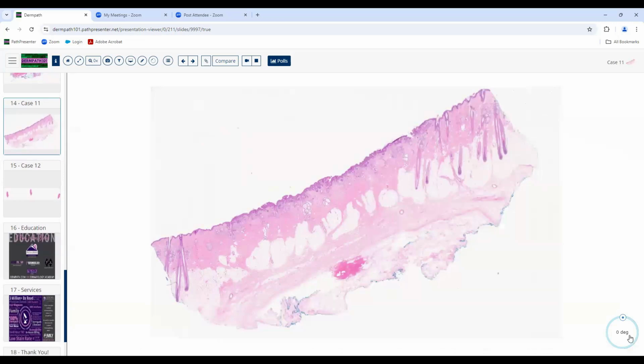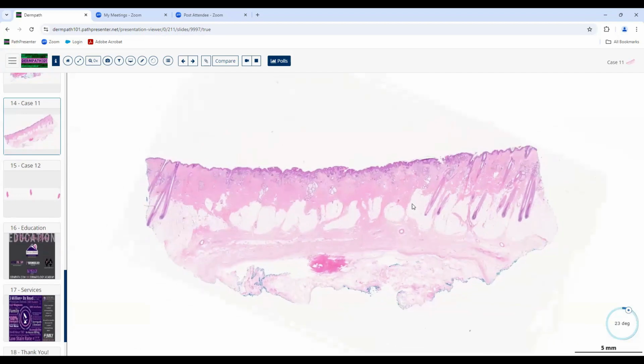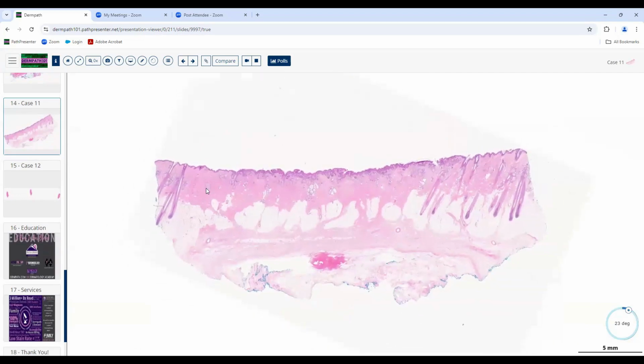Okay, this one you're going to get on the board for sure. So they'll show you this somewhere on the board examination. This is an excisional biopsy, a beautiful example of this from the scalp. And so you see over here, you have all these very deeply rooted terminal follicles in the subcutaneous fat.